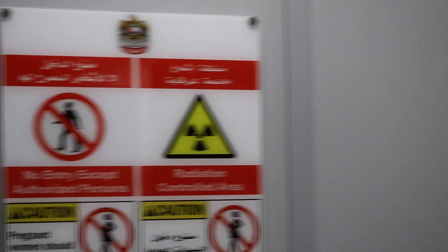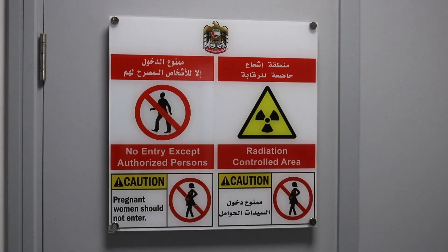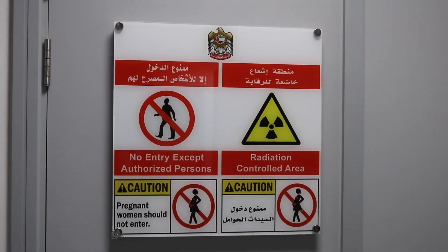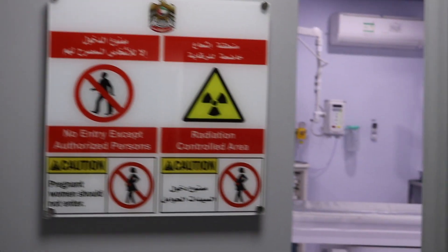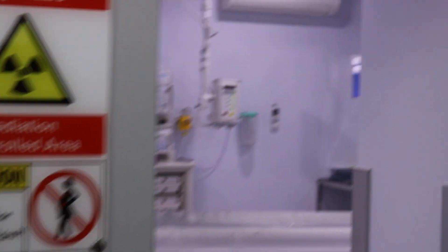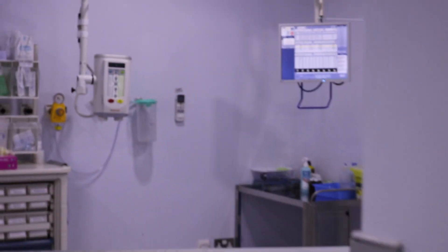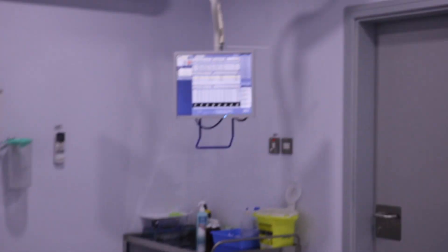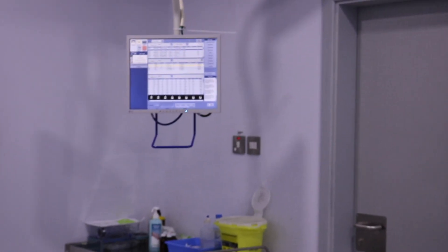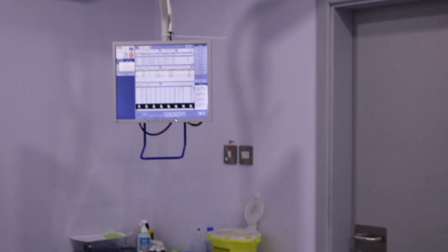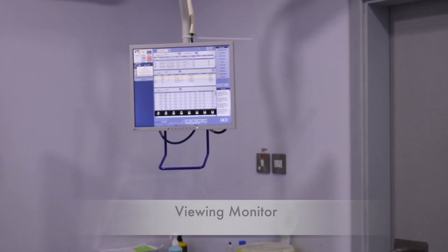As we can see, this is the CT room and no one is allowed to enter except for authorized persons, and pregnant women should not enter this area. As you enter the room, you can see the CT scan machine. Beside that, there are also other available equipment such as the viewing monitor.